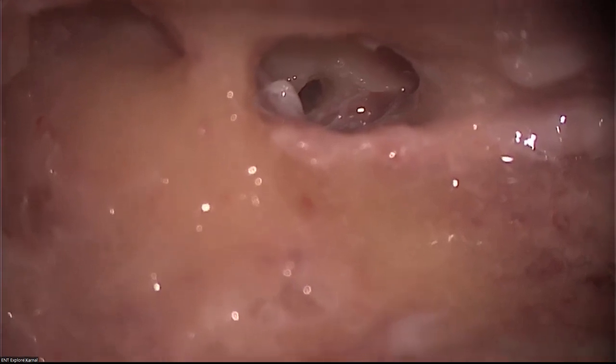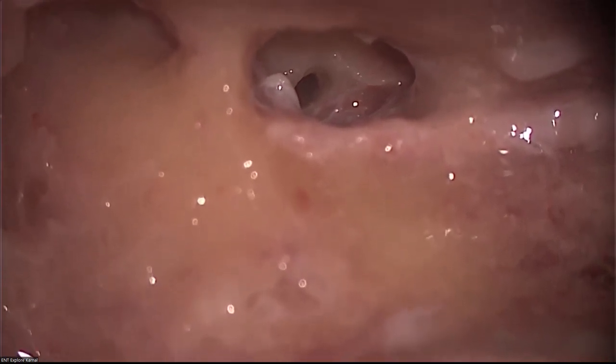One of them, the biggest one, is the scala tympani, which we are seeing. And this scala tympani is closest to the modiolus, so we preferentially want our implant to stay in the scala tympani. It is closest to stimulate the spiral ganglion population in the modiolus.